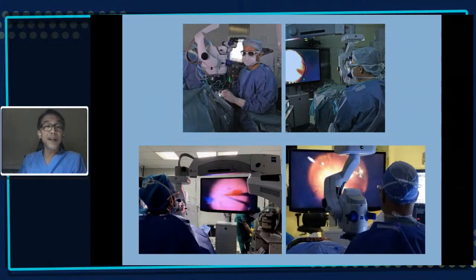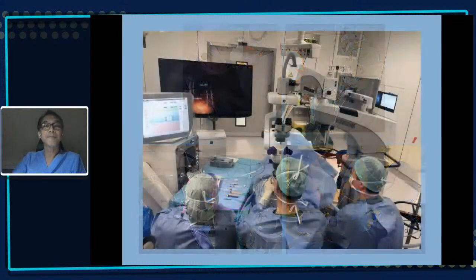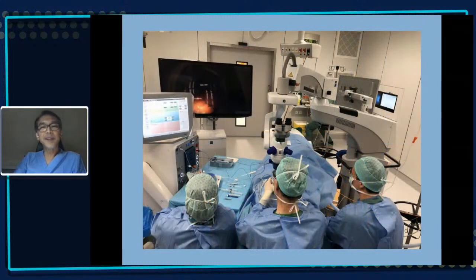And I think one advantage of ZEISS is they own their microscope. I think the better way to do it is to take away that thing over your head and put it on the side so you can look straight. And I would be very excited to see if ZEISS can do that. Even for the assistant, the microscope is actually blocking his view. He would have to reposition himself to have a better view of the monitor.